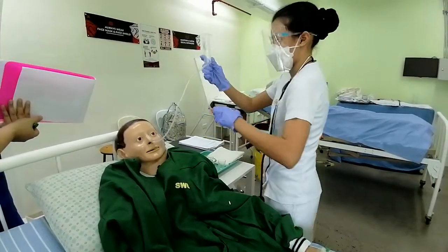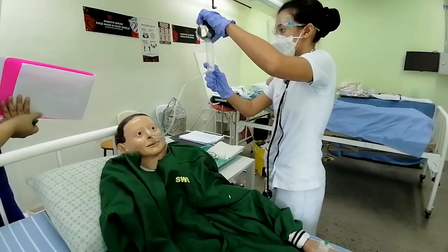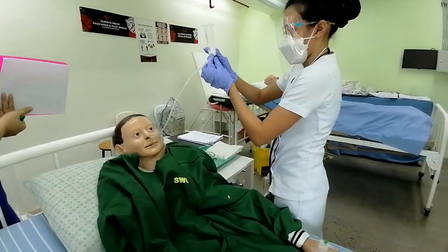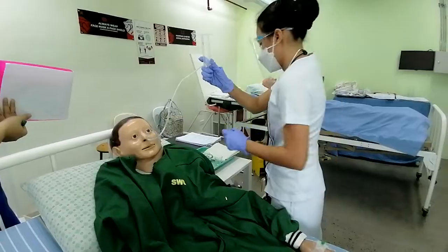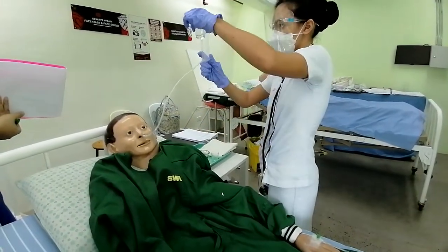Still have available lubrication. And then irrigate it with water also. This is also to clean the tube.